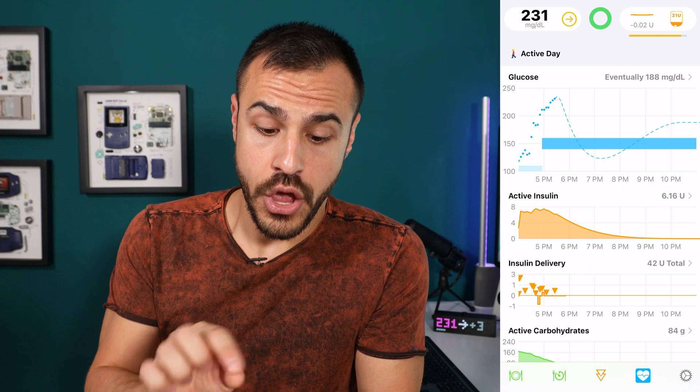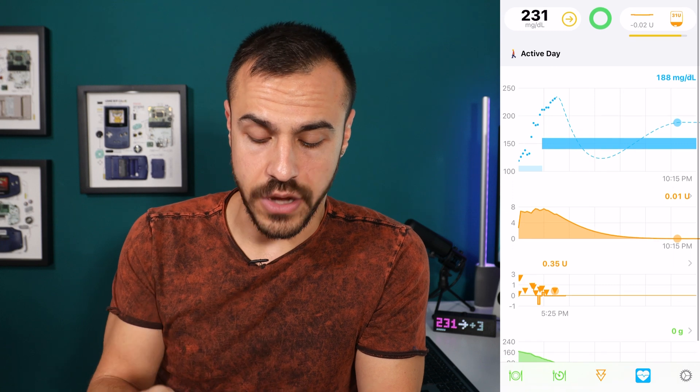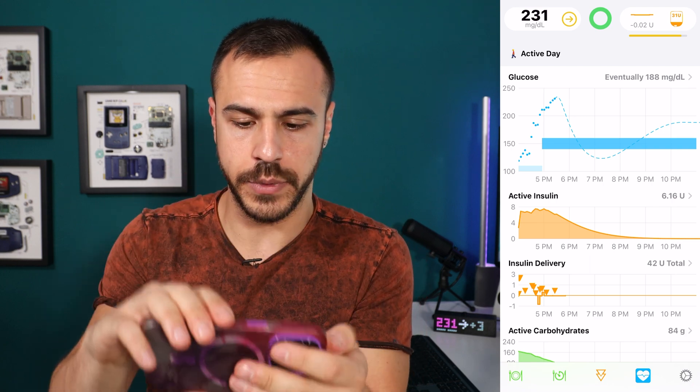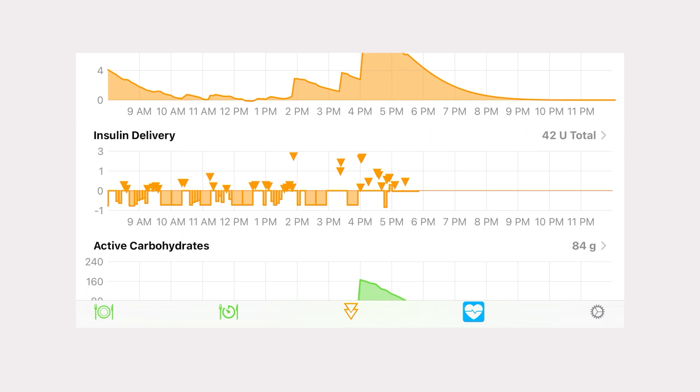This second graph is the active insulin. You can see that I gave myself insulin and then insulin goes away after four hours — it's going to go down. You can see I have 6.16 units on board on the right side. Then you see insulin delivery. If I flip my phone sideways — you see all those squares going down? That is my basal being reduced. If the squares were going up, that would be my basal being increased. All those triangles are boluses — whether I personally was bolusing for food, or automated boluses, which is what I have on. Many of those boluses were completely automated.